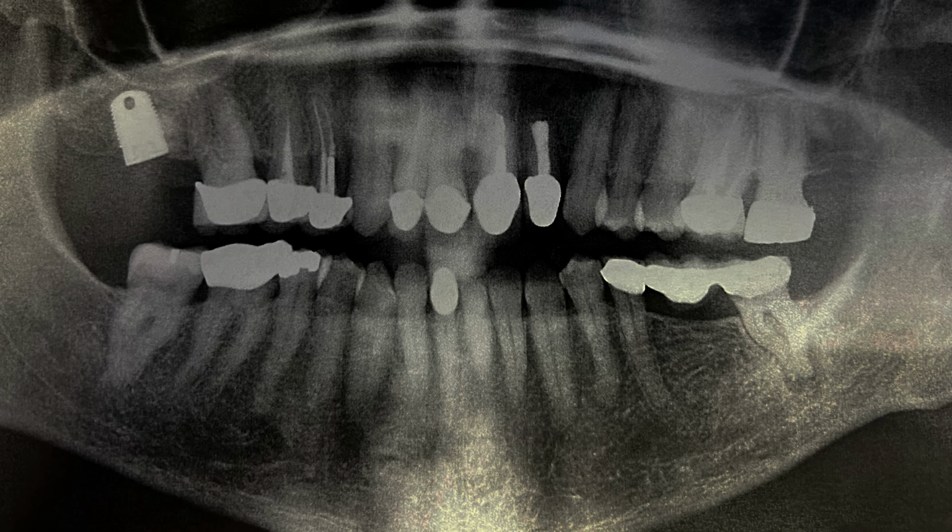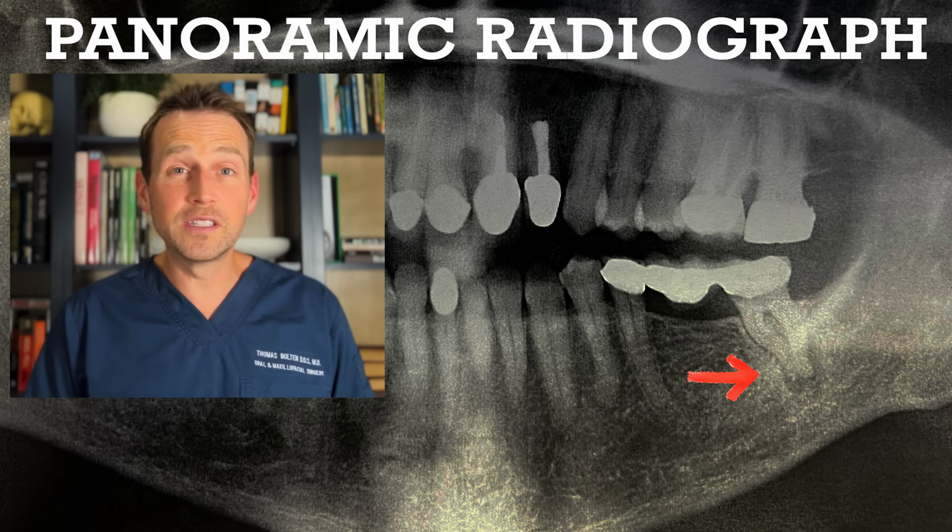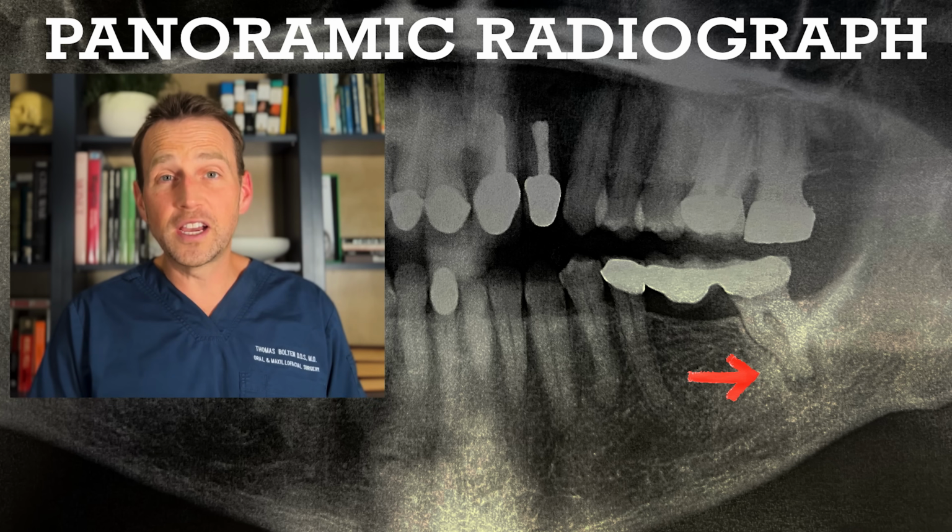I reviewed the Panorex provided, and immediately it's obvious what the problem is. There is a large radiolucency at the base of this tooth, meaning there's a chronic infectious process. The chronic infection finally broke through her mandible and is now causing swelling in the soft tissue of the cheek.